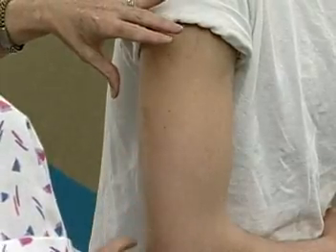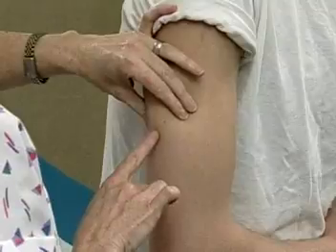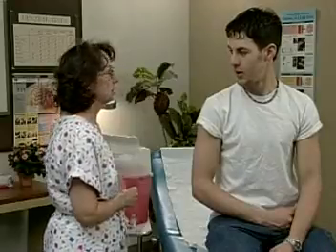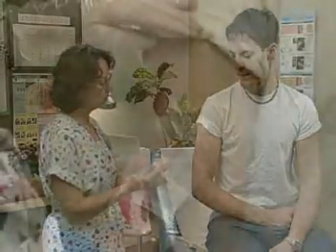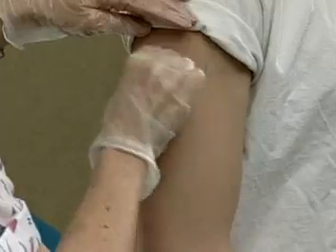Locate the landmarks, the posterior aspect of the upper arm, and choose the injection site. Explain the procedure to the patient. Todd, I'm going to give you your allergy shot today. Dr. Maxter's ordered just a little bit stronger dose, so we'll see how that goes. Clean the site with an alcohol pad using a circular motion moving outward. Allow the alcohol to dry.